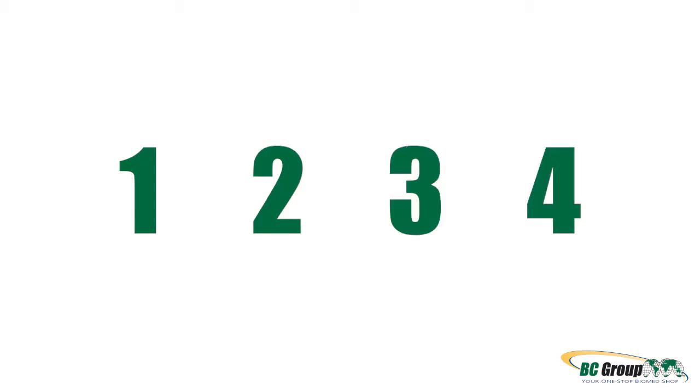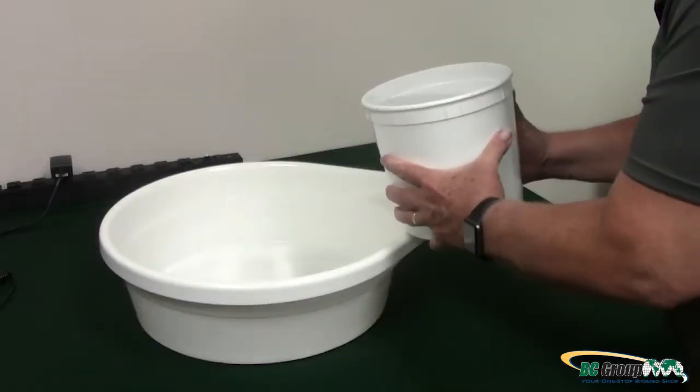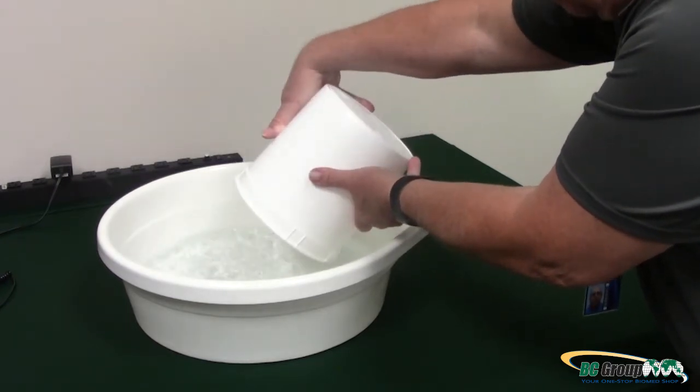We've divided your Ultrasound Leakage Test into four easy-to-follow steps. Step 1: Fill your Soak Tray. When you fill your Soak Tray, use the same cleaning agent used for cleaning the Ultrasound Probe. For recommended cleaners, refer to the Sinocyte Care Card.